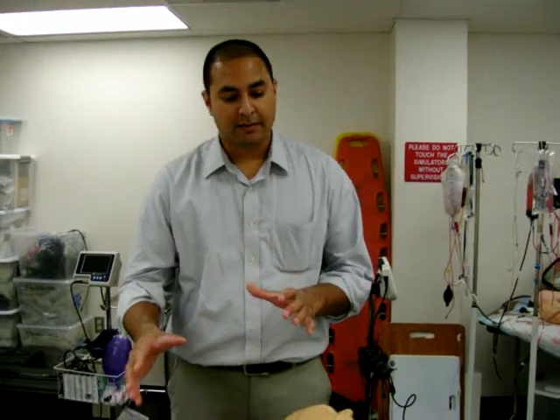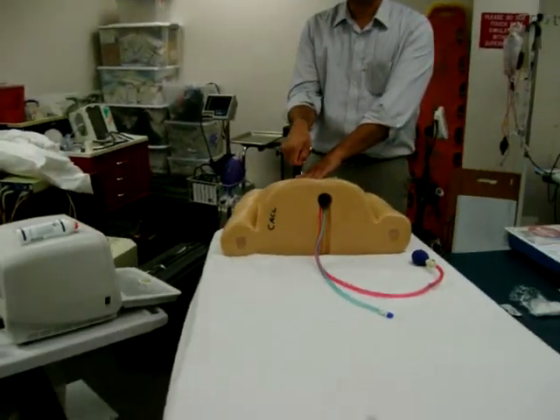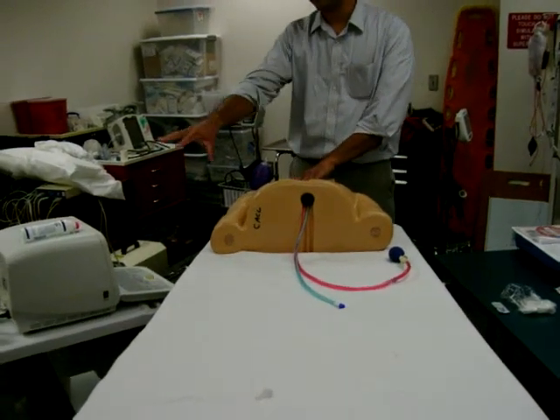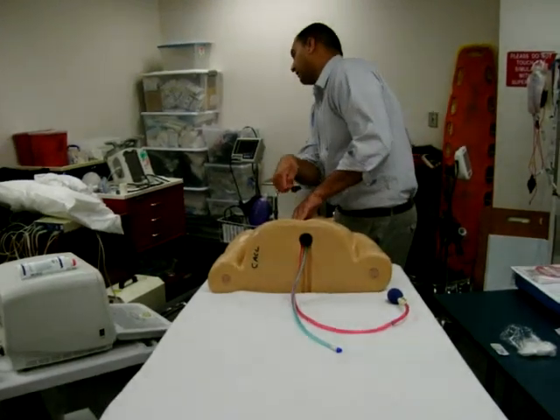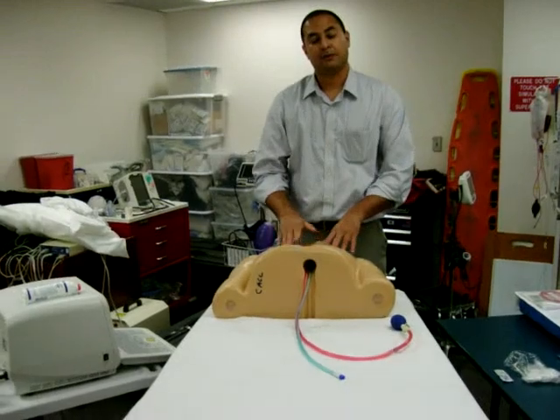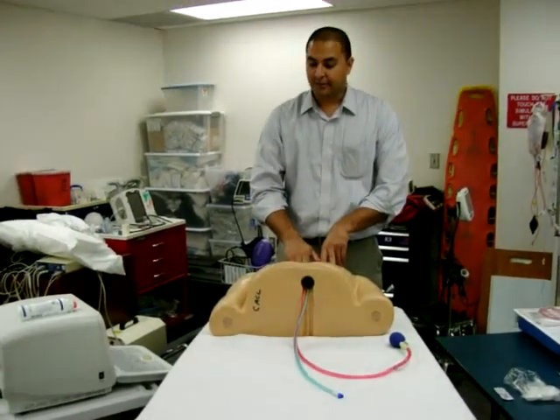The first thing you should be cognizant about is your setup. I always like to have the ultrasound machine opposite from where I'm standing, so if I'm doing a procedure here, I like to be looking at my site and also having my ultrasound information in front of me. You never want to be doing a procedure blindly. All these things should be in your field of view. Today we'll do insertion of an internal jugular central venous catheter.